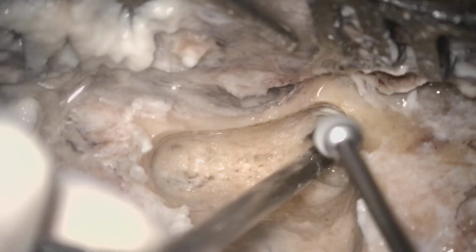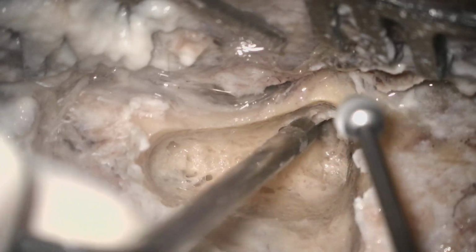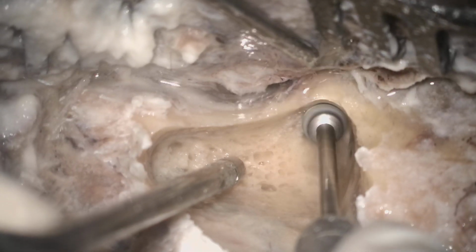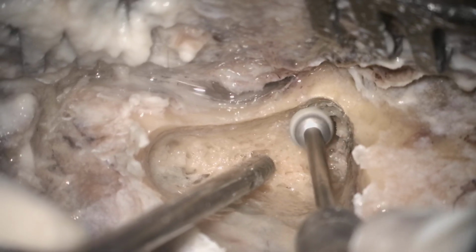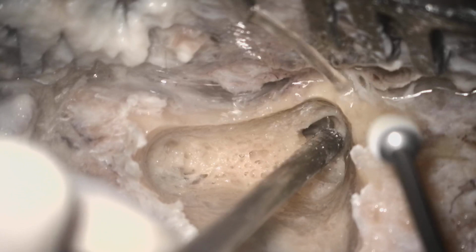First you have to identify the lateral canal, digastric ridge, the incus, and then only you should go for your posterior tympanotomy for middle ear surgery or any surgery where you are not trying to elevate the tympanic membrane, but you are going inside the middle ear cavity through the mastoid by this combined approach tympanoplasty. So you continue drilling this part.